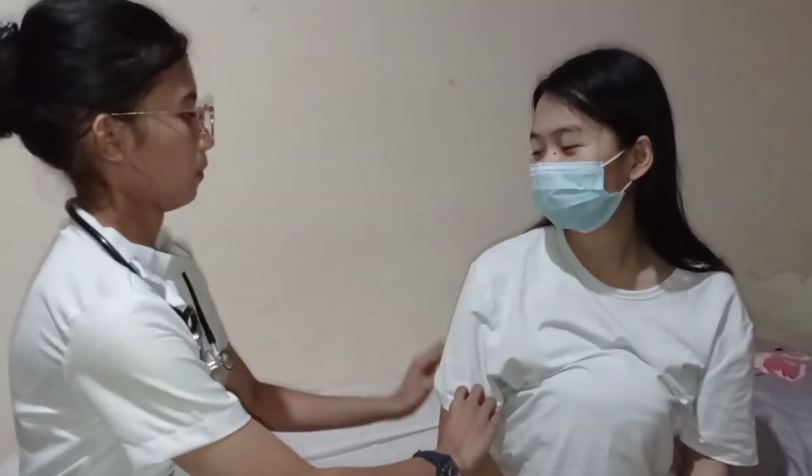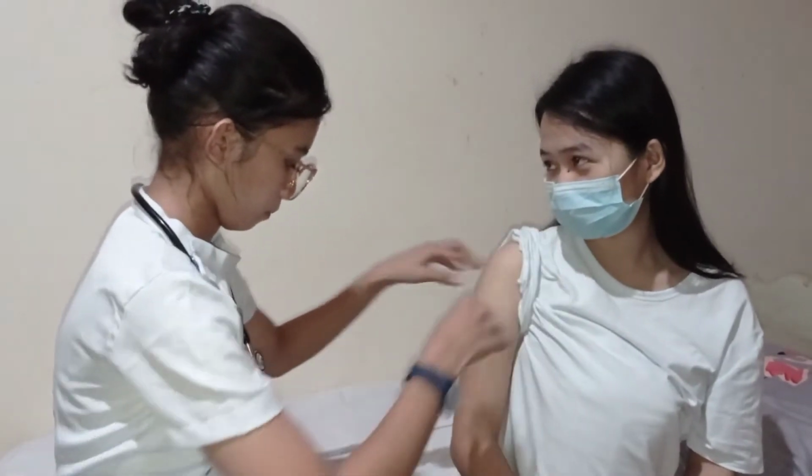So the first step in the assessment is to check the vital signs of the patient. The first thing to do is to check the blood pressure of the patient. So ma'am, I'm going to check your blood pressure. If it's okay with you, ma'am, I'm going to do the procedure. Okay.